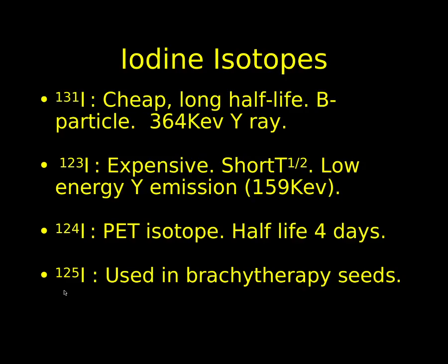It does have a long half-life of 8 days, and you might wish to note that if you give the patient a therapy dose and they take an airplane soon afterwards, because there's a possibility that they may activate radiological alarms in airports. It also produces a beta particle, which is how it can be used for therapy. In addition to the beta particle, it does produce a gamma ray which we can use in imaging, mostly a 364 keV gamma ray, and that's quite a high energy photon, so if you're going to perform imaging, you really will need a dedicated high energy collimator in order to get optimum imaging.